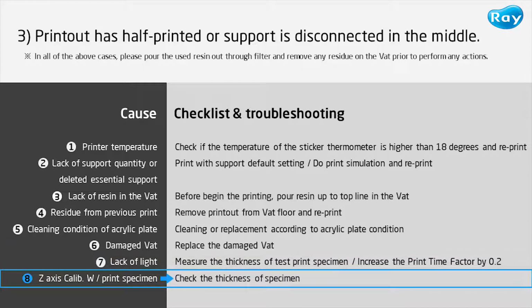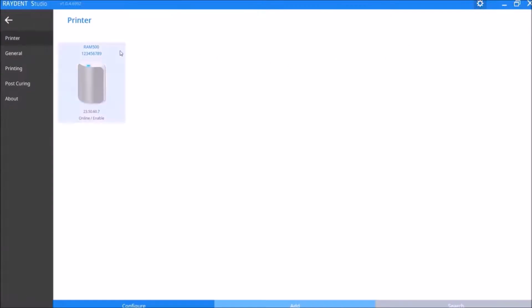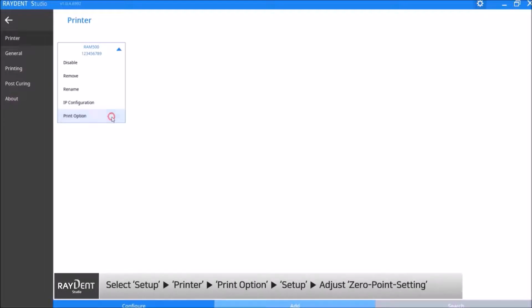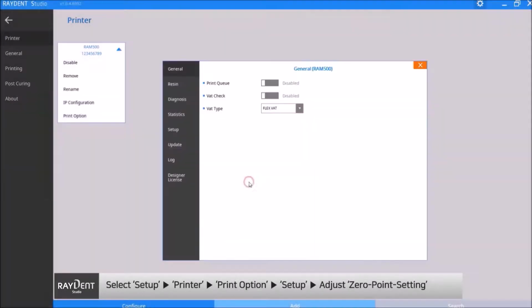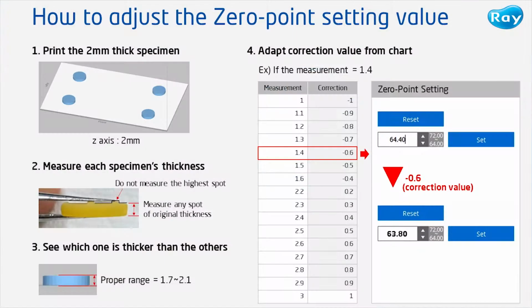The next cause may be due to the 0-point setting of the Z-axis. Click Setup on the top right corner of the studio. Select the printer and click the arrow. Click the print option at the bottom and go to the Setup tab. And you'll see the 0-point setting value is entered as a number. And let me explain in detail how to adjust it with the following example.